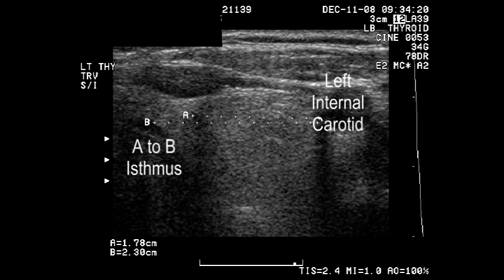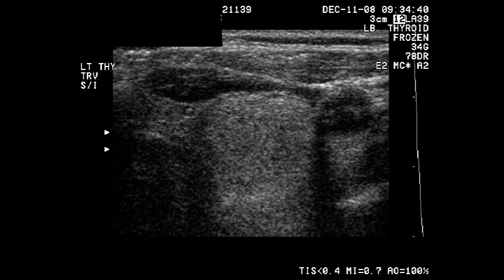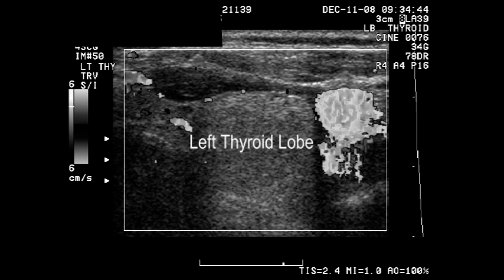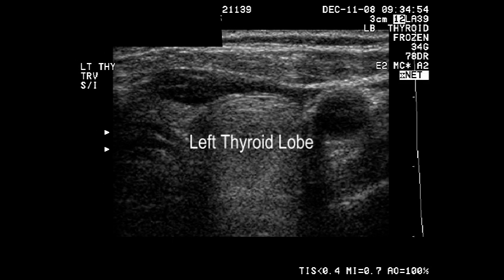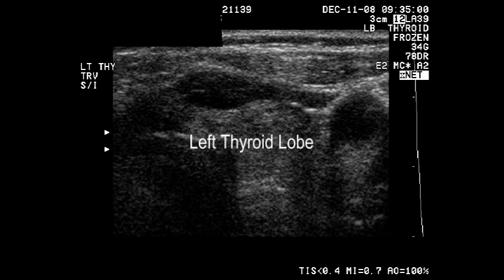In summary, this is basically a normal thyroid ultrasound. There were a few small tiny cysts found, but with practice and orienting yourself by finding the vessels and the trachea, you can rapidly find your way around.